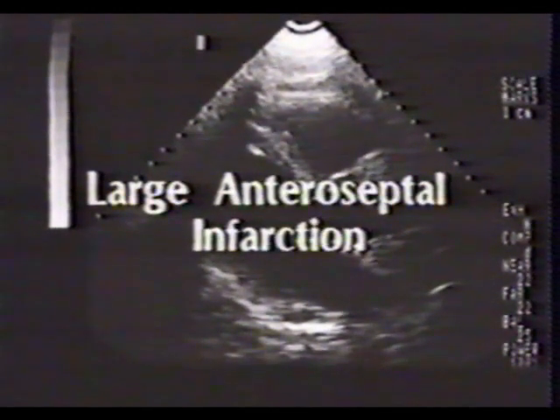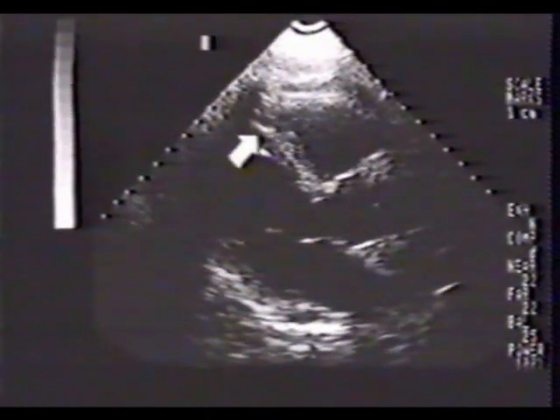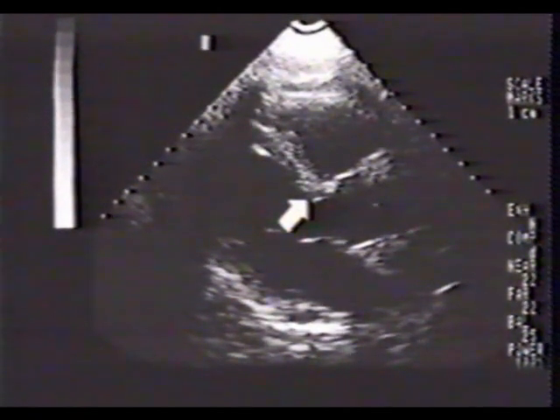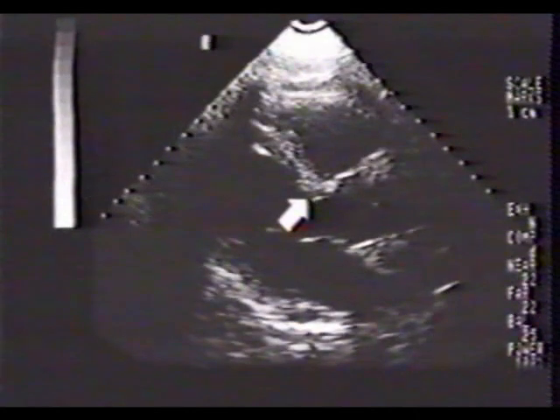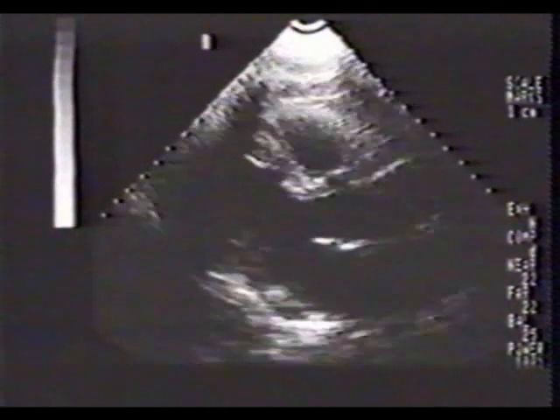Echocardiography was performed in the emergency room. This is the parasternal long axis portion of the exam, which immediately tells us that there is a large septal infarct. There is severe hypokinesis of the anterior septum, including the basal segment, which correlates with severe stenosis or occlusion of the proximal LAD. His anterior wall and apex were akinetic, such that his wall motion score index was 2.1.